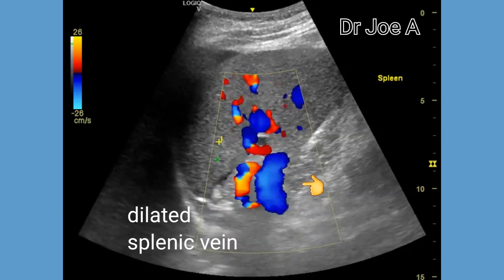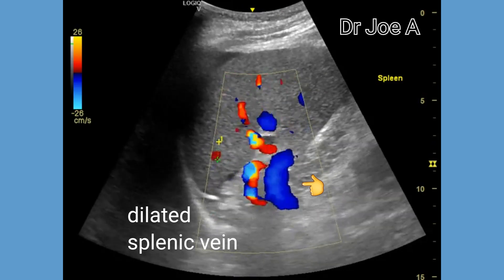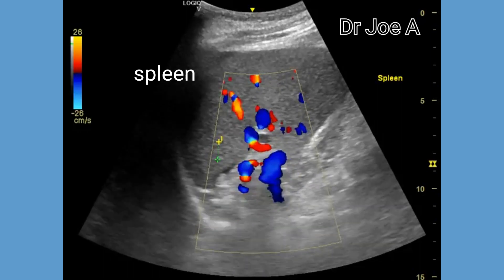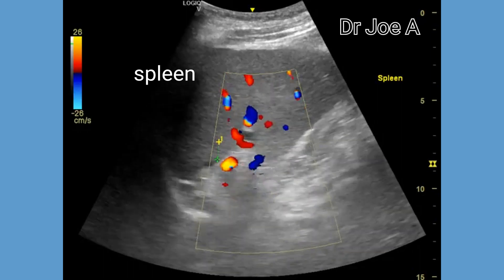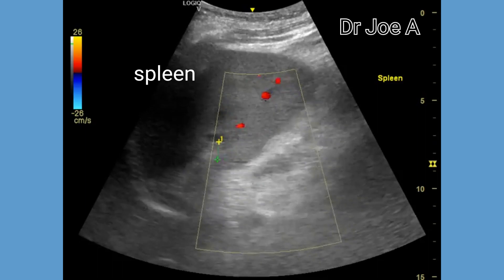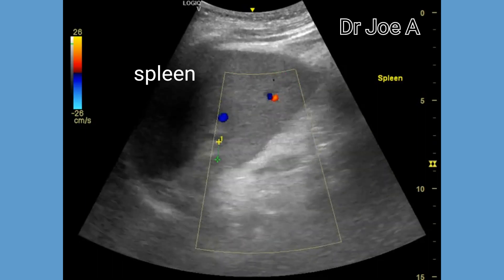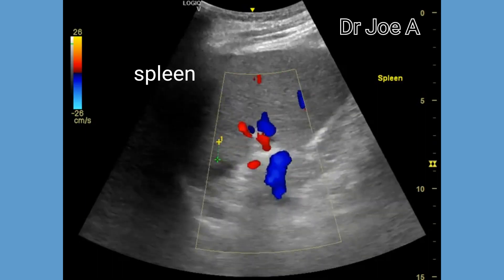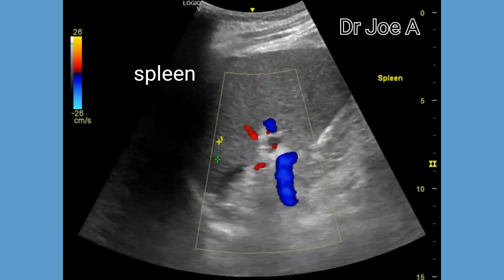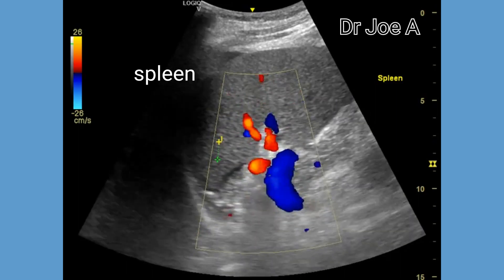The splenic vein is seen in blue color here. Adjacent to the splenic vein is the splenic artery, seen in red. There is no evidence of splenic varices in the splenic hilum region — this is one good sign that we see in this patient.